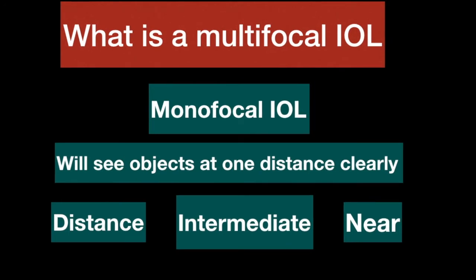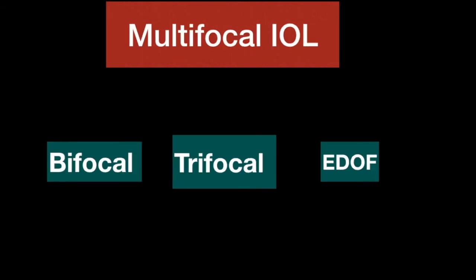So there has always been a desire in some patients who would like to do activities without having to depend on glasses. This is where multifocal IOL comes into the picture. For such patients, bifocal, trifocals or EDOF lenses are available.